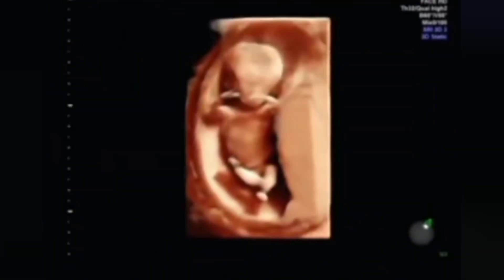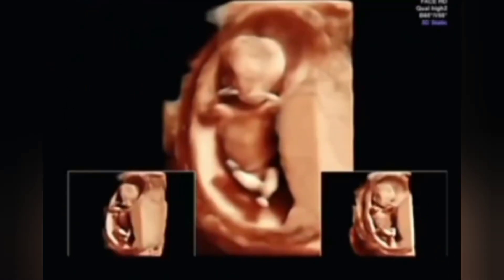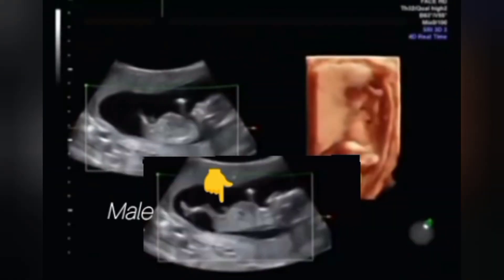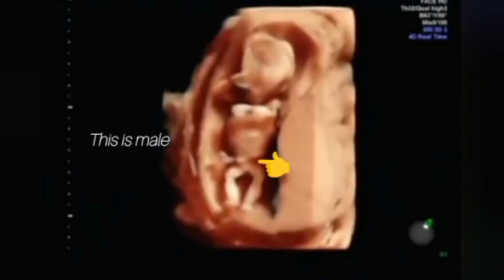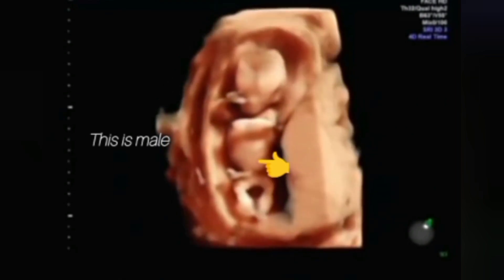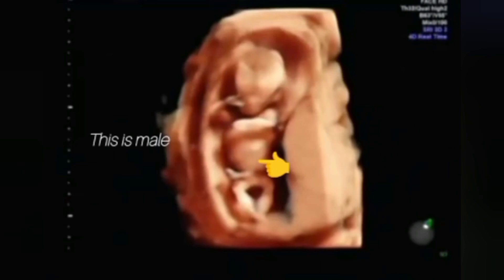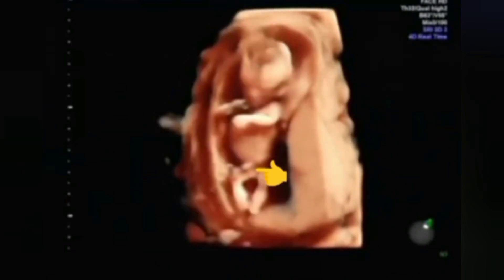Look at this beautiful picture of this fetus. You can see his gender very clearly — he is a male child, at about 13 to 14 weeks of age. Yes, this is a male fetal.